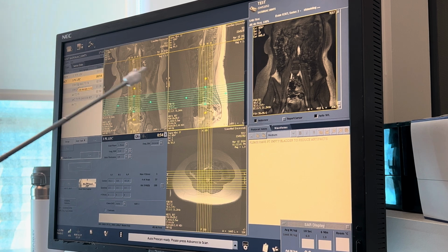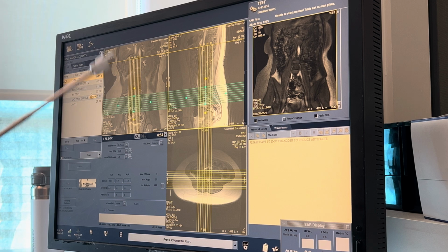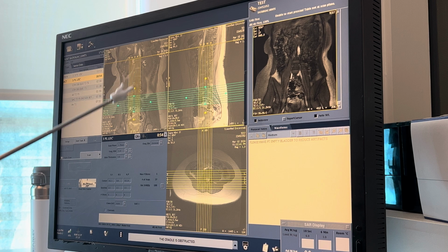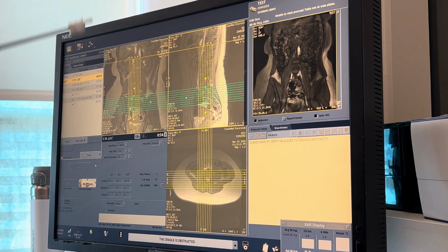Basically, if you landmark up here, this is placed at isocenter. But when we place and prescribe images down here, then the patient has to move up or farther into the bore so that now this area is at isocenter. Okay, so that's what's happening. See him? Yeah.